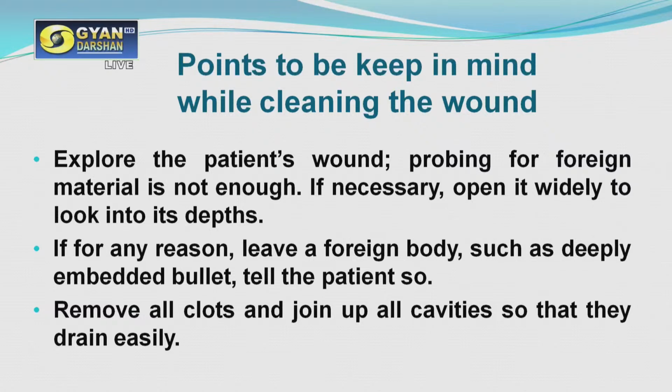Then if for any reason a foreign body is left in the wound, such as when it is deeply embedded, it can be a bullet injury which is deeply embedded in the wound, then tell the patient that it is a very deep wound. You have to inform the patient and remove all the clots and join up all the cavities so that they drain easily.